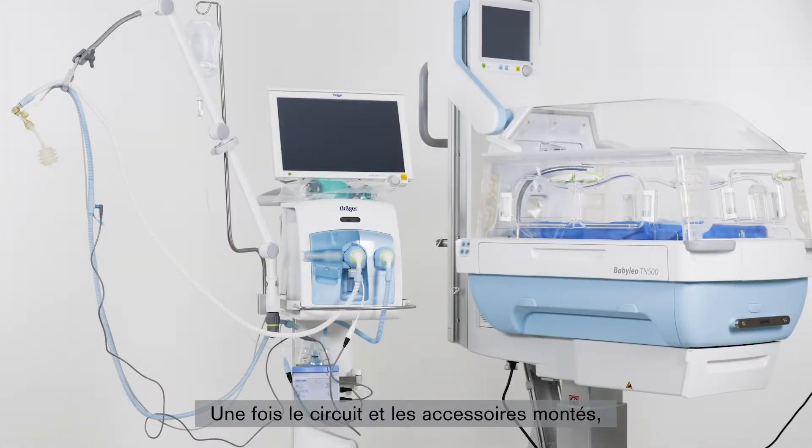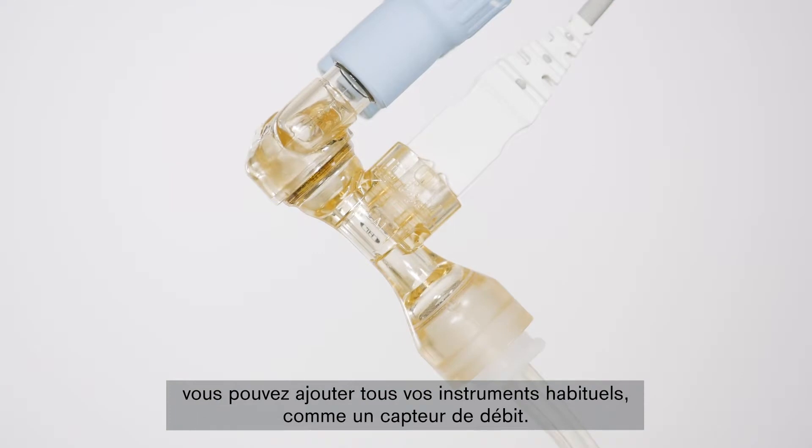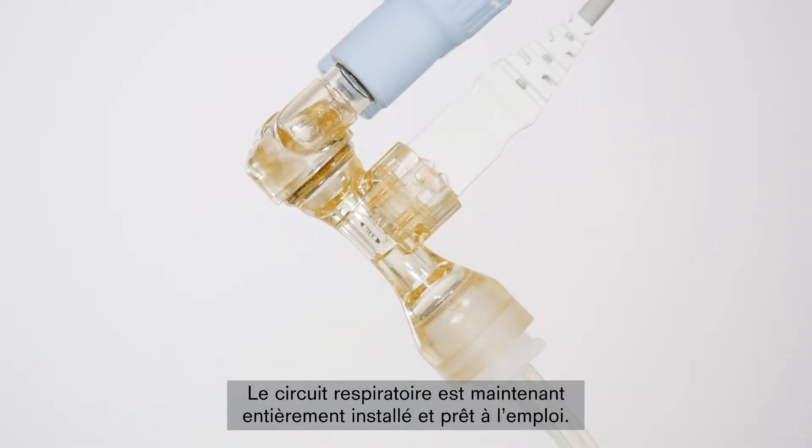After the circuit system and accessories have been assembled, you can add all the necessary components you would normally use, such as the flow sensor. The entire breathing system has now been installed and is ready for use on a patient.